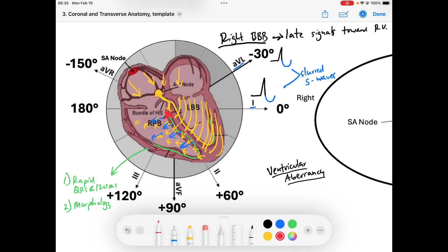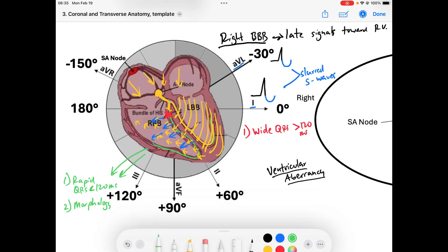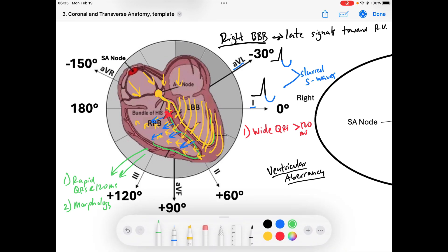Let's talk about the criteria we'll see in a right bundle branch block. First, the QRS has to be wide — greater than 120 milliseconds — because the normal rapid QRS conduction requires the highway system to be working, and it's not. Second, in leads I and AVL — the lateral leads — we will have late slurred S-waves, representing late depolarization away from the lateral leads as forces head toward the right side of the heart.